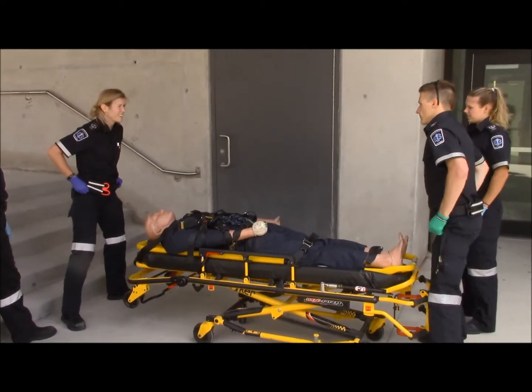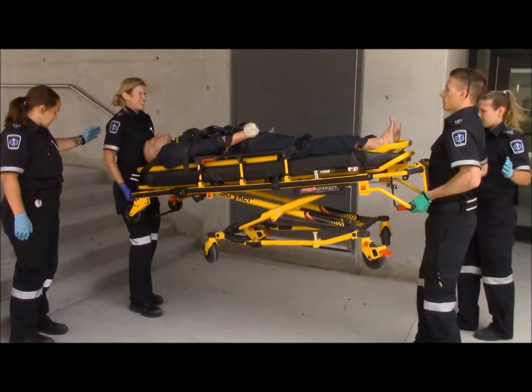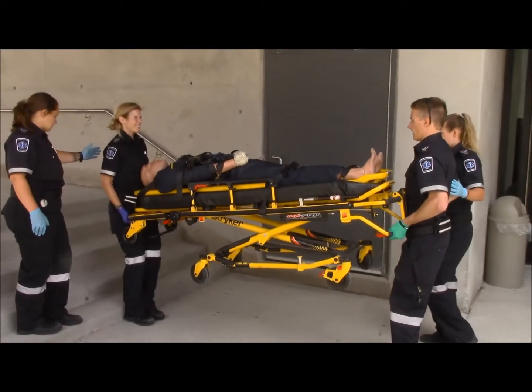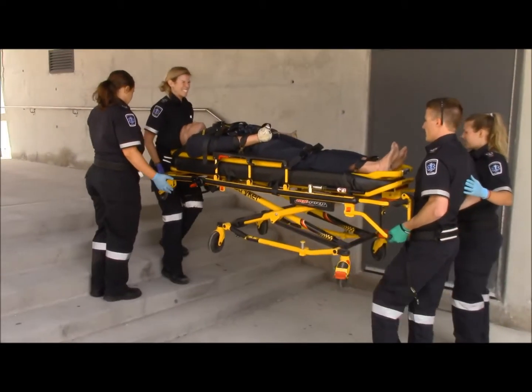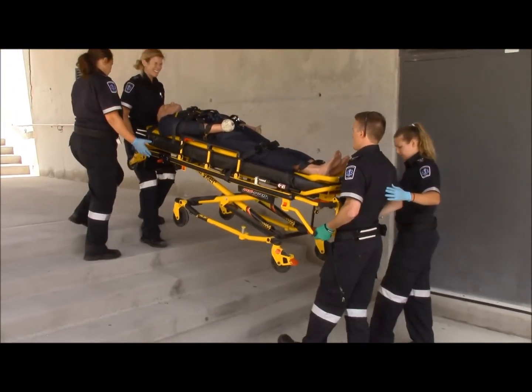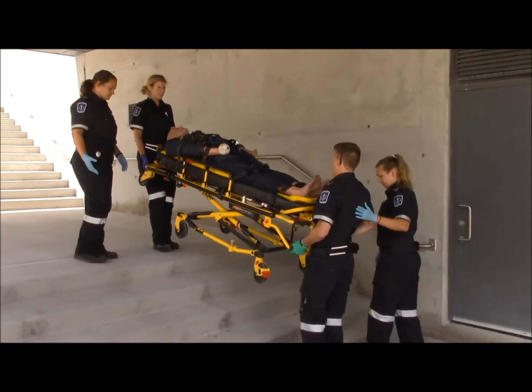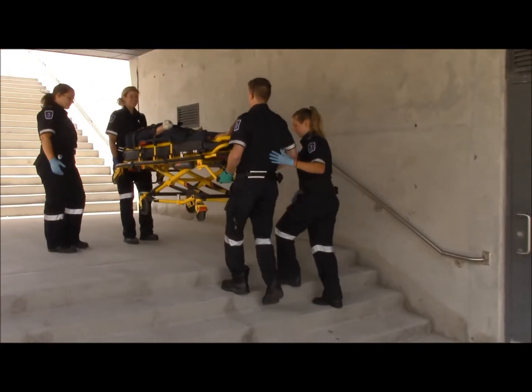Now they've traded places and Jennifer is at the head of the stretcher, and you'll watch Brianna back her up to the first step. We don't want her to trip over the first step, so Brianna has backed her up. And Lee is keeping an eye, who is the back spotter. She's keeping an eye on Braden as he approaches the step there. You can't hear, but she's communicating that to him. And they'll begin the lift up.